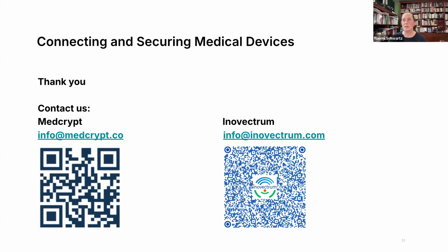Yeah, that's absolutely right. If you claim that there isn't any port because it's not accessible to the user, and FDA sees something in a diagram that shows there's a USB port, they're going to call you on that. Not necessarily saying, hey, you're lying, but they're going to say you forgot to tell us something. If they see persistent behavior of that nature, they might start asking whether or not you're lying to them, and you don't want to instigate some kind of directed inspection, which does in fact happen when FDA suspects that a manufacturer is lying to them.